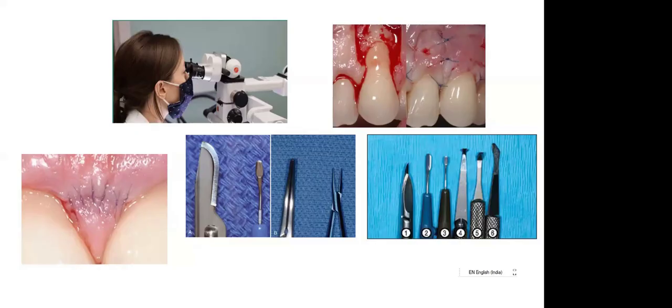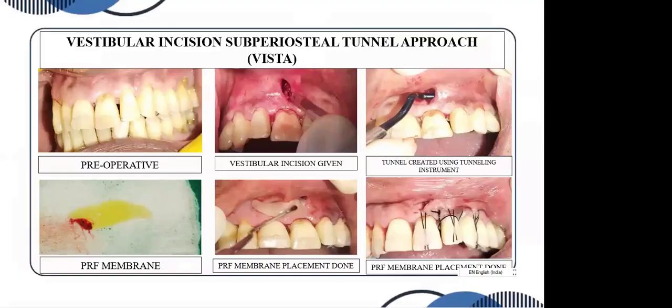Now this is beforehand. Now if the implant has been done and if the black triangle has developed, the only way out is the papilla reconstruction surgery. As I showed you in the picture, using again a connective tissue graft and/or the PRF, and then we need to do a papilla fill surgery, like putting this graft and then coronally advancing and suturing it.